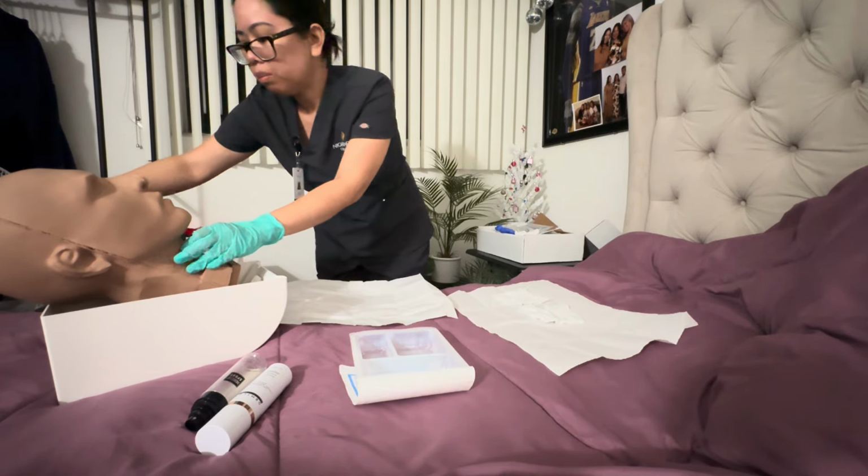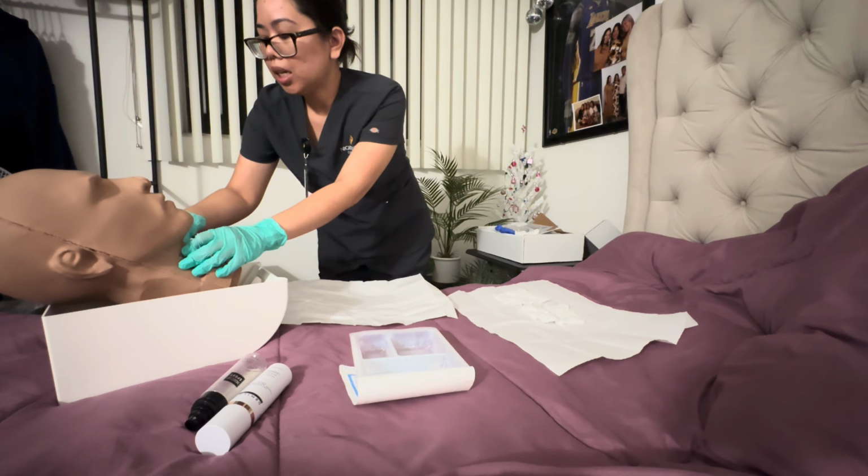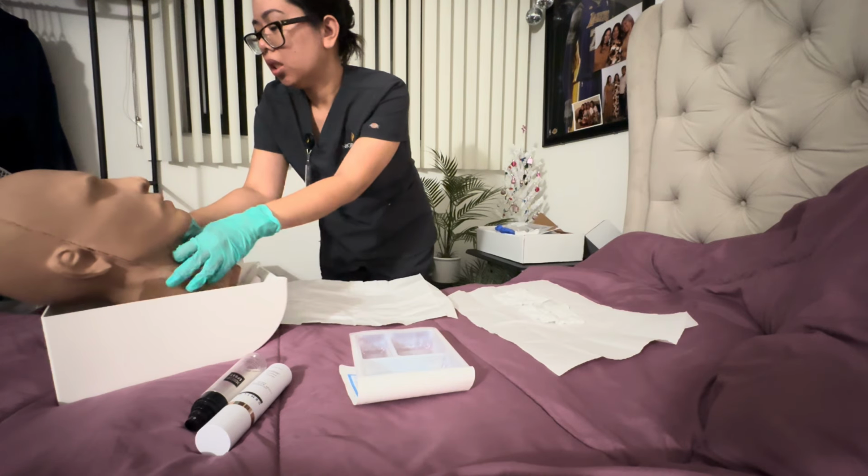Okay, and then when you put it around the patient's neck, make sure that the tie has no twists or turns.